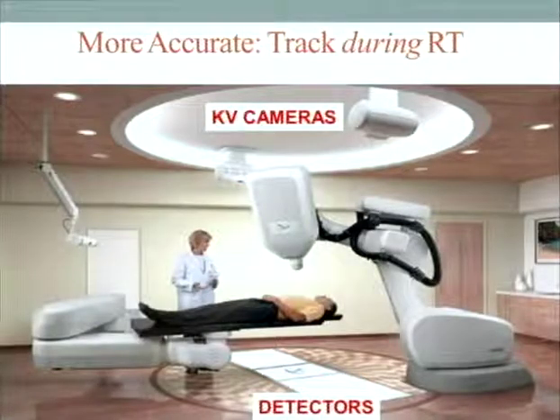So that's conformality, but what about accuracy? Well, the unique feature of the Cyberknife system is it's able to track a tumor during treatment. And it does that two ways. First is the KV cameras that are situated on the ceiling. They're able to detect tumors in the stomach, in the thorax or abdomen, where there are radiopaque markers placed in or near the tumor. The patient's respiratory pattern is tracked with this camera, which is called the Synchrony camera.